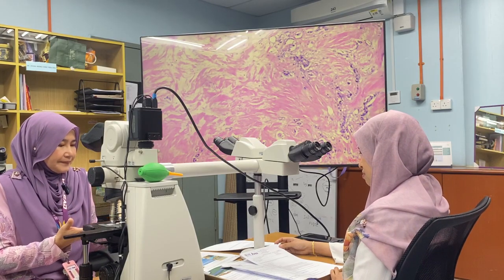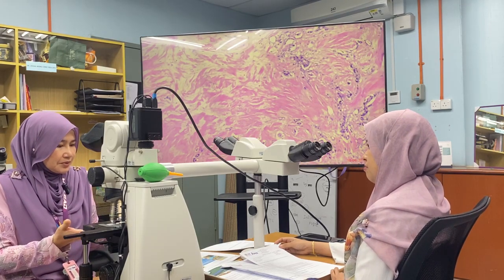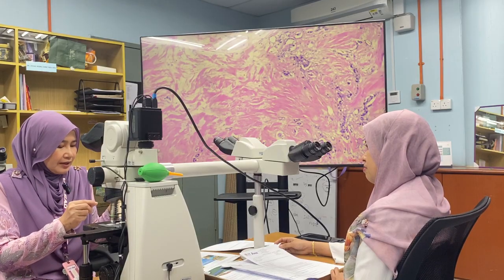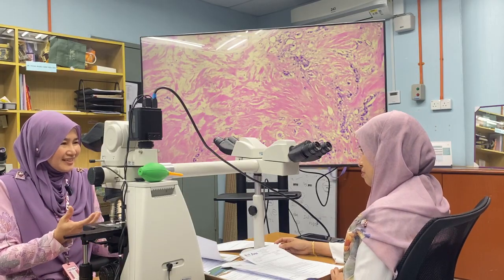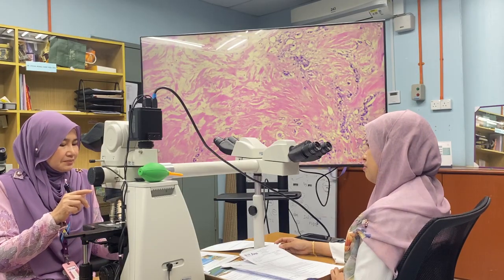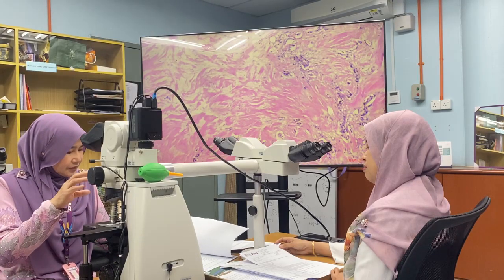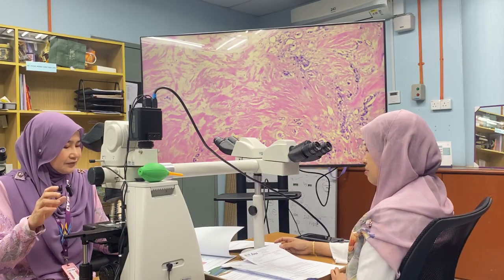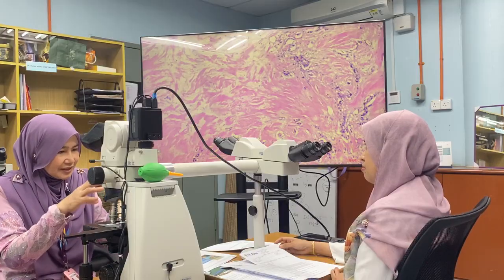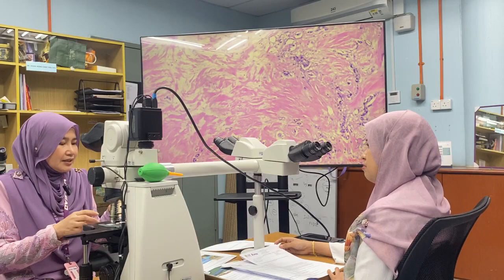These are the things that you missed. And then for the tumor pathologic response, you need to describe well how the appearance is. Sometimes the tumor becomes concentric. Sometimes the tumor becomes small, or what we call scattered foci. Scattered foci, concentric shrinkage of the tumor, scattered foci. You need to mention that in your report.